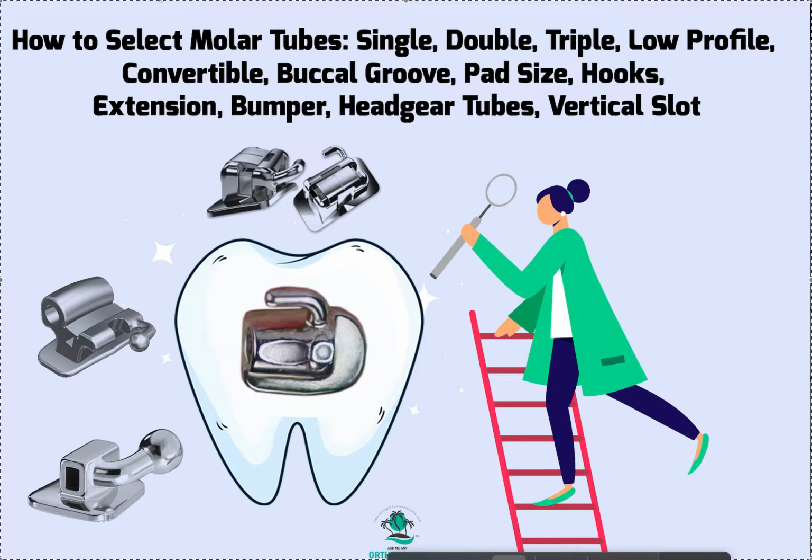The other thing you have to pick is an 022 or 018 slot. I usually recommend that all general dentists pick 022 because it's a little more forgiving, a little easier to get used to, not quite as hard. I personally prefer 018, but that's just me. I started off on 022 and then graduated to 018.